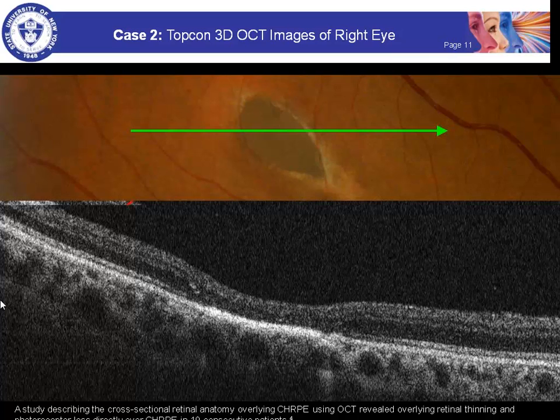Well, I've looked at all of them, and they're quite similar. There's not that much of a difference between them. The Heidelberg is the most expensive, and it may take the longest to do. You might want to argue that it possibly has the best resolution. The cheapest on the market at the present time is the OptiView, the iView, and surprisingly that one has quite good resolution. I can't say anything negative about any of them. They're all very, very good systems.